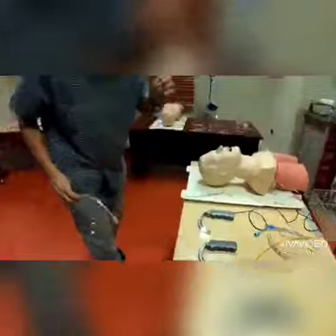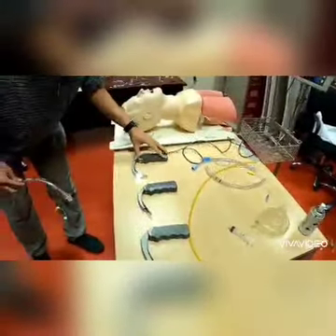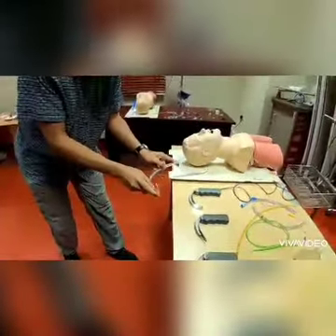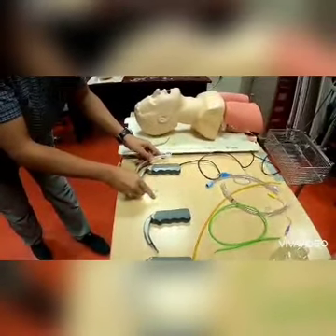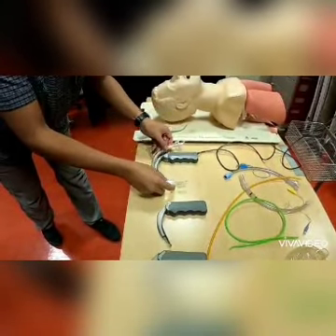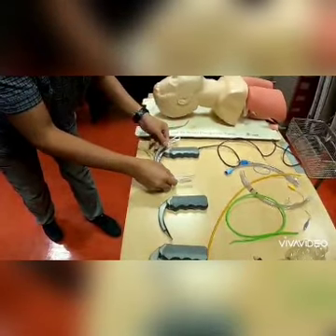The most important step before you start intubating using CMAC is to put a stylet inside your ET tube, and you have to mold the shape of the ET tube according to the shape of your CMAC blade. If you're using a D blade CMAC, it has to be this shape so that when you're inserting through the vocal cord, it follows the blade.